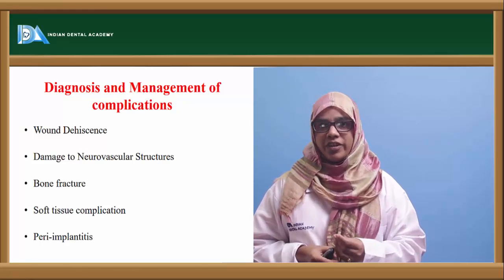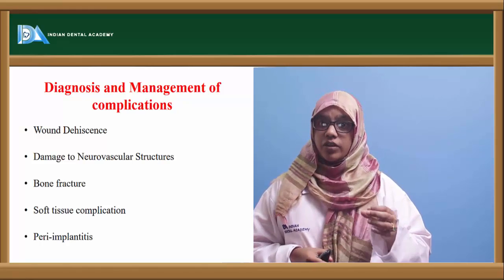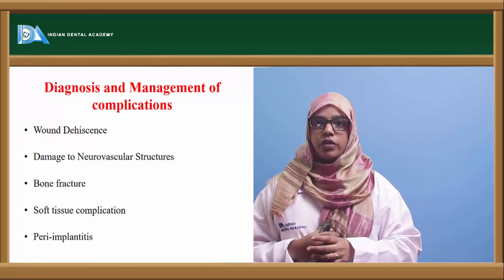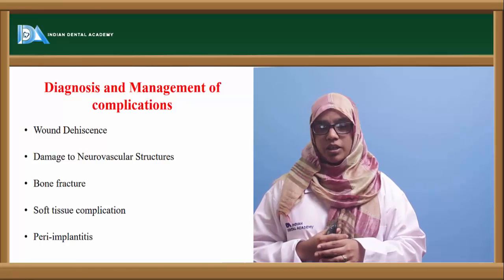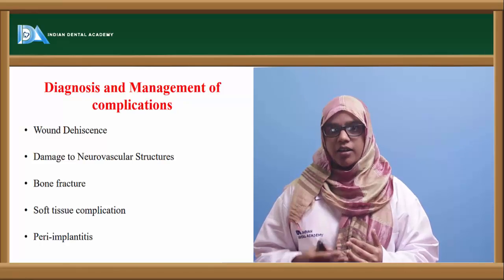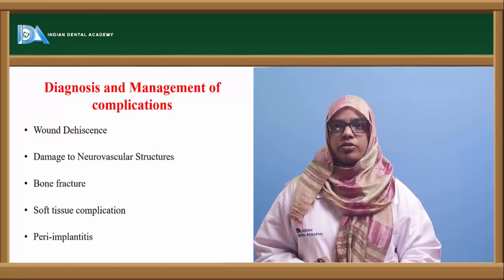Then sometimes bone fracture can occur. As I mentioned earlier, if the buccal or lingual crest is thin, it might fracture when you are placing the implant or doing the osteotomy. So when you anticipate that a fracture can occur, rather than doing an osteotomy, do an expansion.